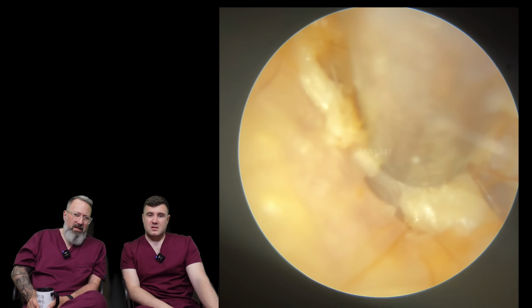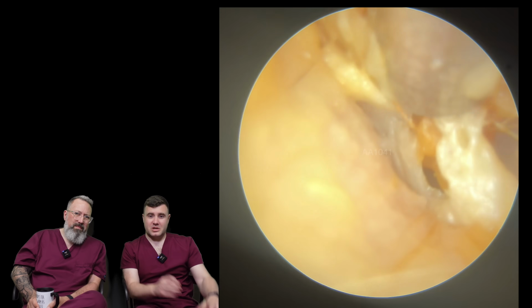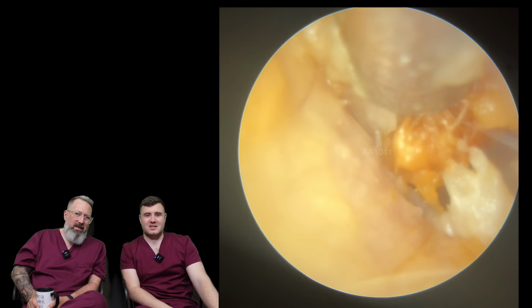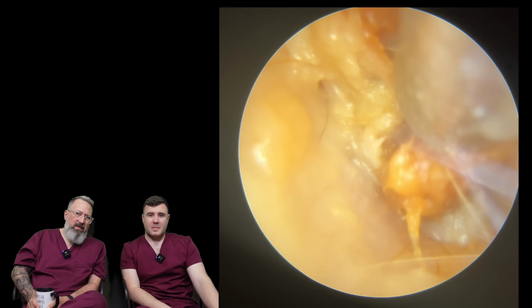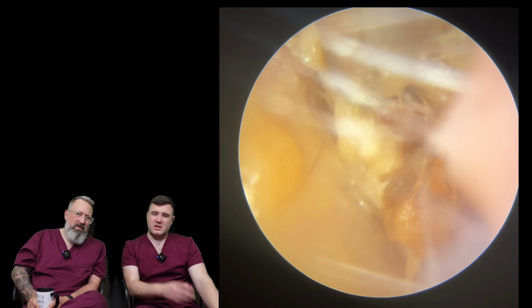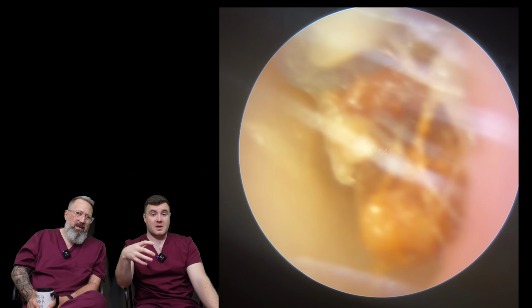How thick that skin is. You can see how pale that skin's gone as well. Oh, it's trying to suction, collapse again into that tube. Gosh. Yeah, all these little soft bits on the outer edge. This is what we normally expect the sodium bicarbonate to do.